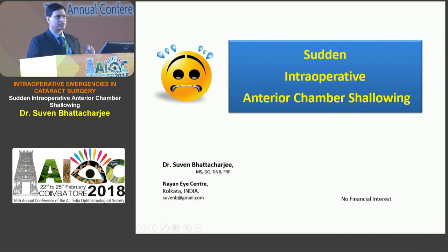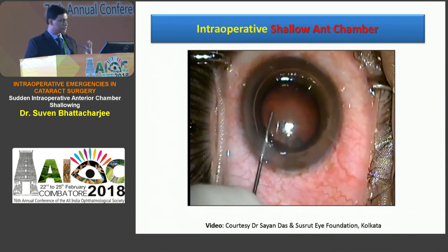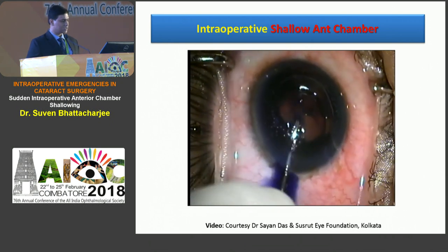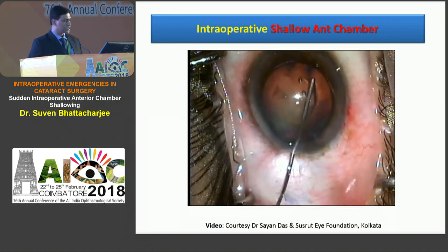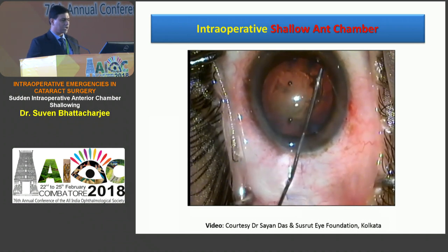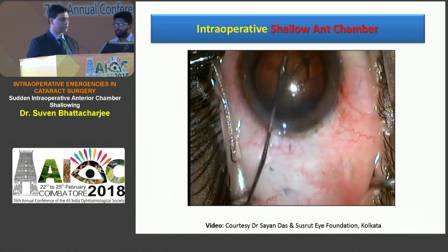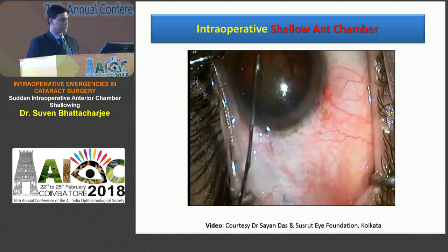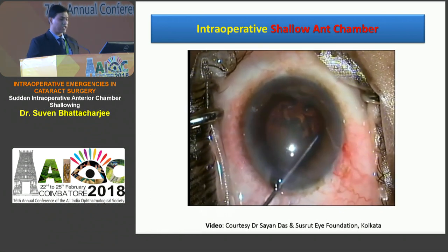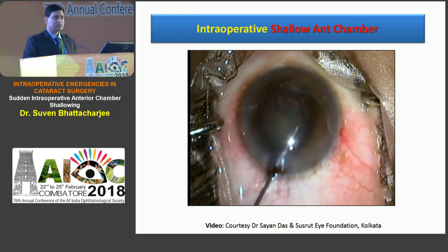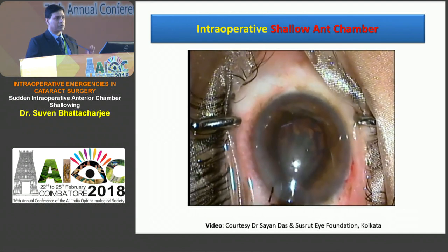Let me walk you through a case being done by a trainee surgeon. There was a supervising surgeon also, but let's see the sequence of events. This is a fairly nice anterior chamber — that's how the case started. After the viscoelastic, the anterior chamber is fairly well-formed. Now during hydrodissection, the surgeon is struggling — the anterior chamber is shallow. He's trying to push it back but very little fluid is coming out. It's getting difficult. Another attempt at hydrodissection, and the iris prolapses — this is an ominous sign. The anterior chamber is shallow and we are in for trouble.